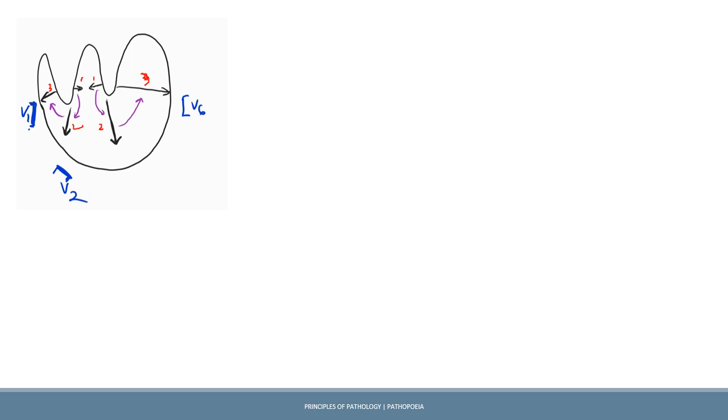Now one thing I would like to say here, the principle over here is that we actually measure the resultant of both the vectors, right? So here in the first one, the resultant is towards the right side, and that's because the left dipole is larger in size and magnitude because of course the left ventricle wall has more musculature, and that results in a greater magnitude of that vector.